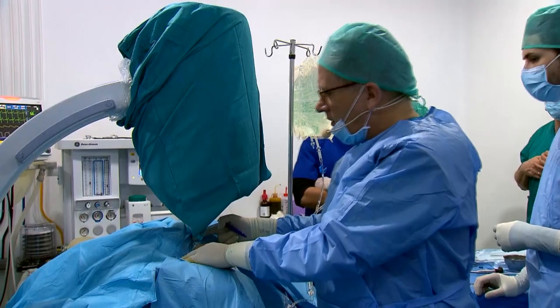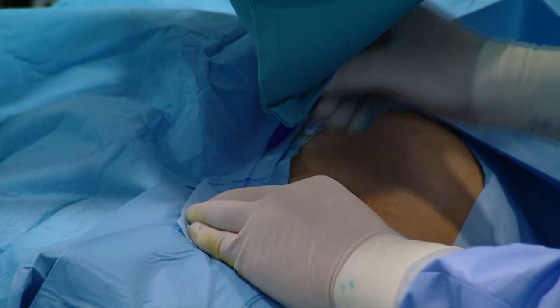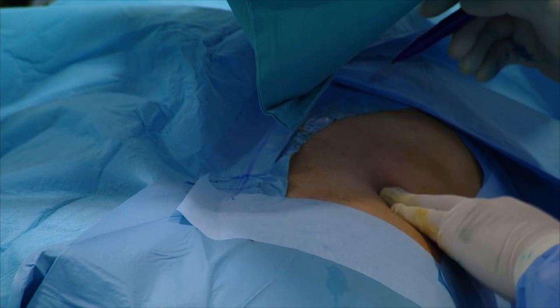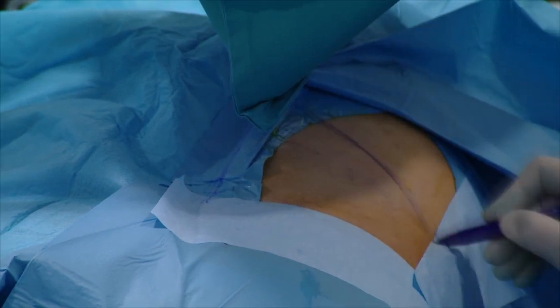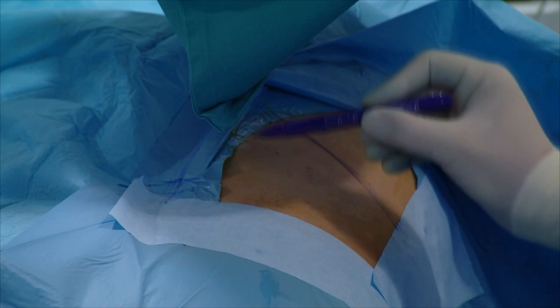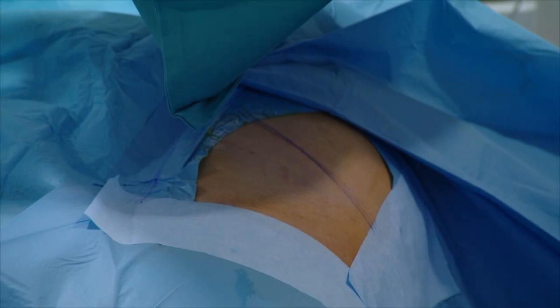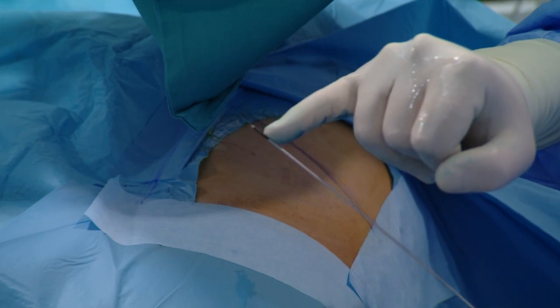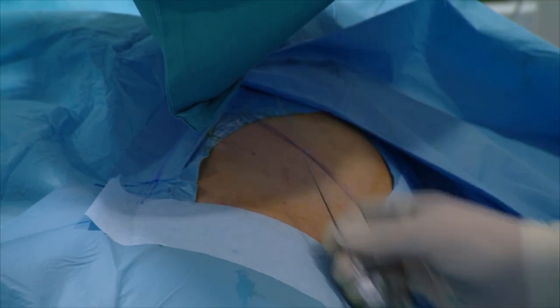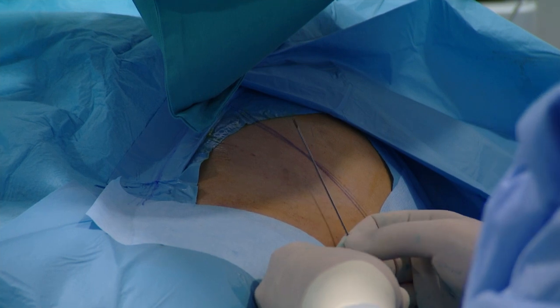Now, let me explain the technique we are using to do the puncture. This is a spine over there. Could you show this with your camera? We see it very clearly. And this is the lower margin of the ribs, which means we have to do the puncture in this area, somewhere here. This puncture is a three-dimensional problem. What I do is, I take my needle at first and put the tip of the needle exactly in my target area, and this is done by fluoroscopy. I put my needle on the skin of the patient and place the tip of the needle in the target area. Now let's have a look at the X-ray, please.